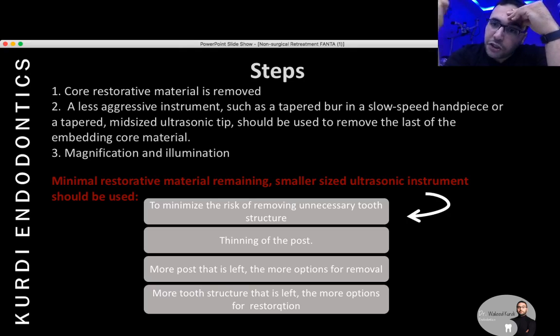You can use it to remove the remaining part of the core restoration around the post. And then magnification and illumination are very important.